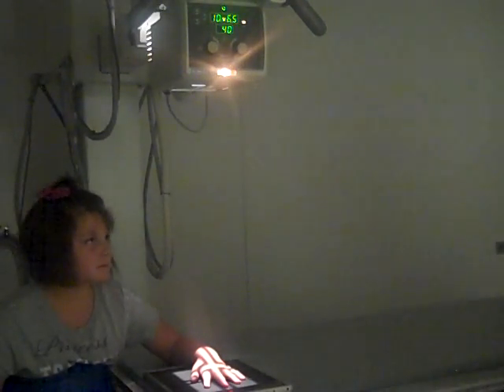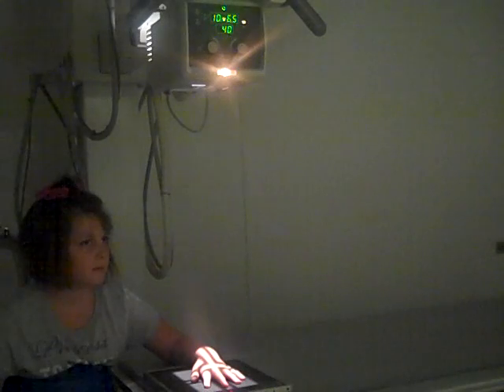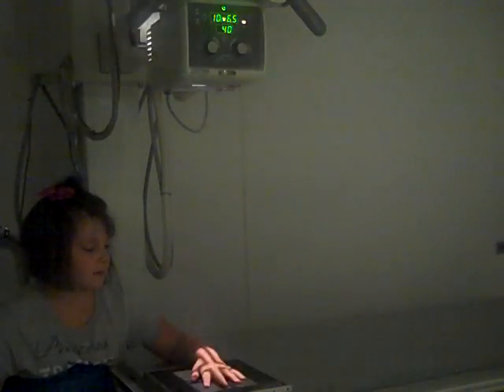Hold very still. Step out of the room. Hold very still for me. Good. You may relax.